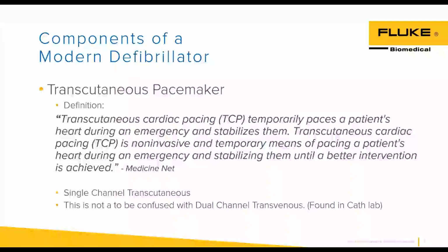Transcutaneous pacemakers, according to Medicine.net, transcutaneous cardiac pacing, TCP, temporarily paces a patient's heart during an emergency and stabilizes them. You can read the rest of this, but it's a non-invasive and temporary means of pacing a patient's heart during an emergency and stabilizing them until a better intervention is achieved. So if you have a patient who has a low heart rate, like a bradycardia rhythm, this is going to get them up to a higher heart rate. These are typically single channel devices.